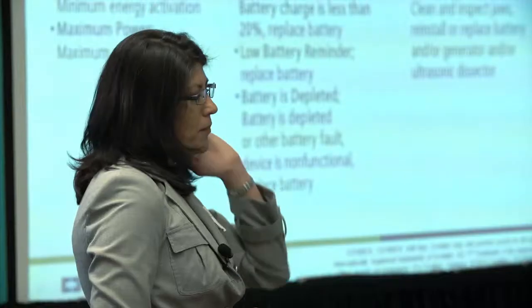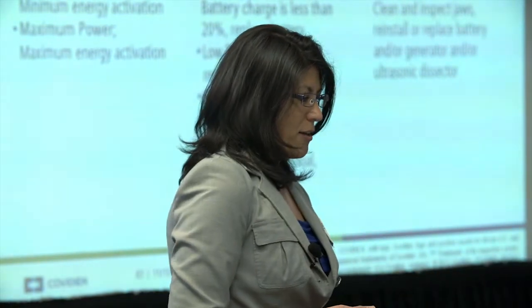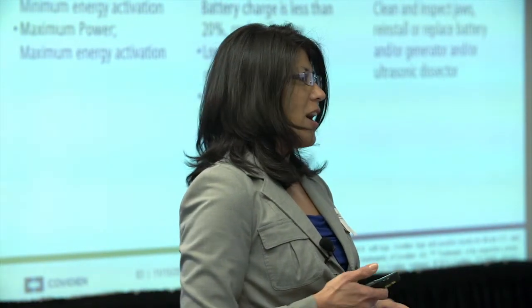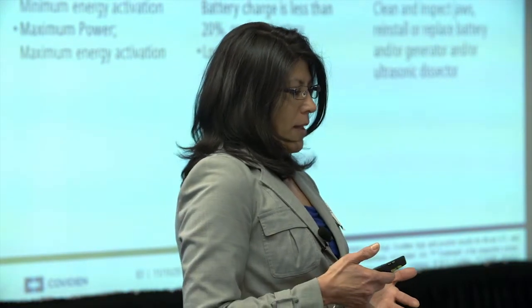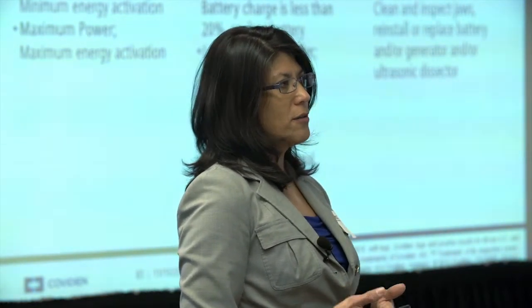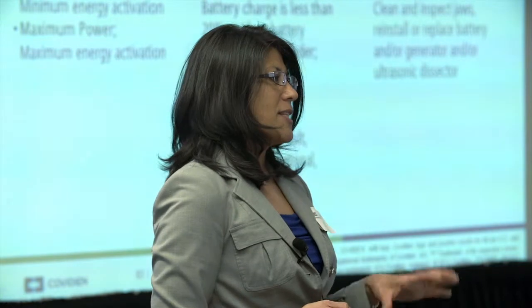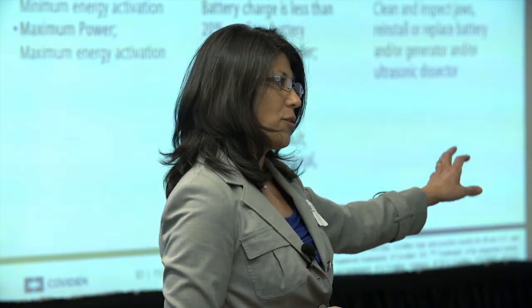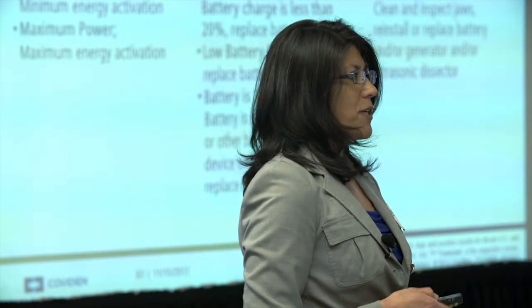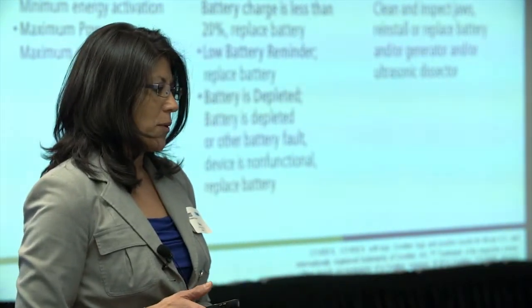So for the surgical use, what we found out was the surgeon wants the device to work always. So as best we could, we make the device work always. Audio is a primary indicator for the surgeon. The challenge, I should say, with our device was that we had a fixed volume on our handpiece. And if you go to standards, there's a minimum level, but the standards indicate the device is actually 3 meters away where that's measured. So taking into consideration you're now in the surgical field, does it really need to be that loud? So we had trade-offs there that we had to work with.